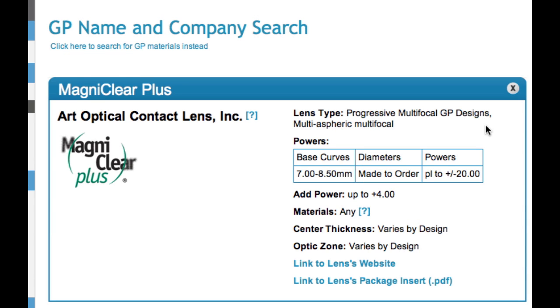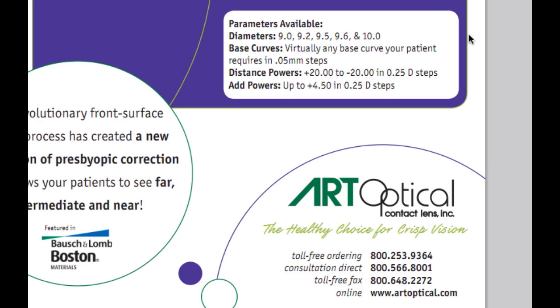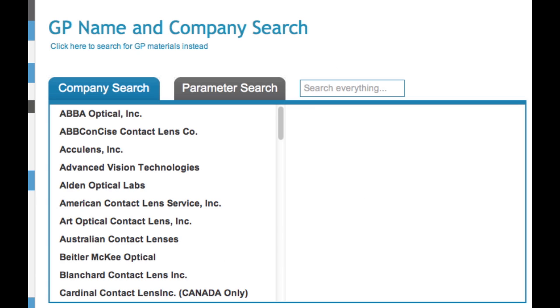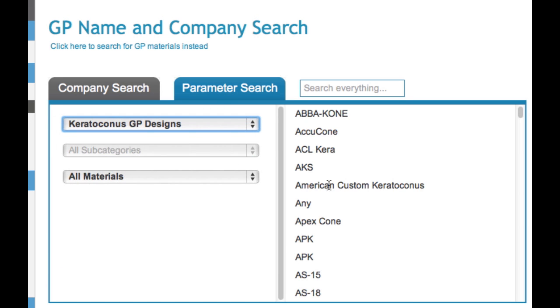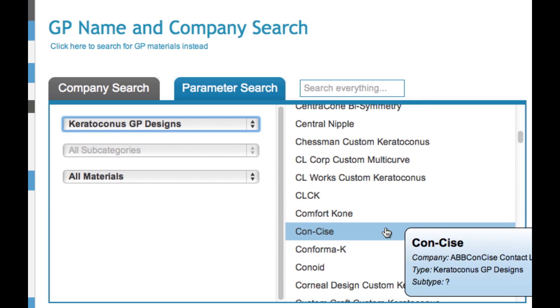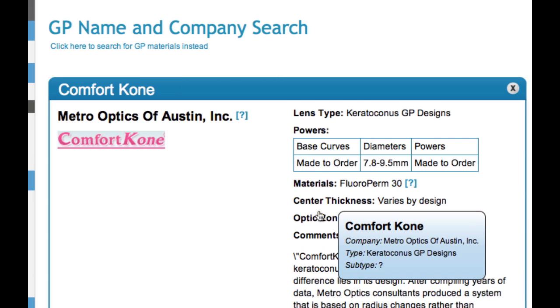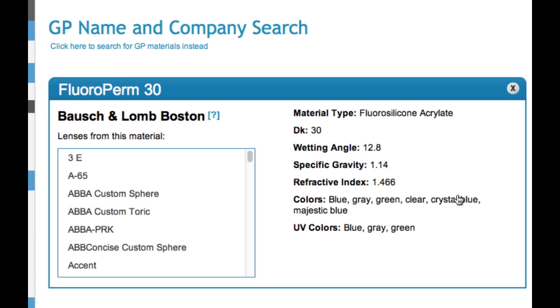For a lot of lenses, we try to have links to the website or, if possible, to a package insert, so you can get more information about fitting those particular lenses. We also have parameter searches where you can search by design categories. So if you want to find all keratoconus lenses, you can click on that and find all the keratoconus lenses. You can do that for multiple types of bifocal lenses too. Also, if you want to learn more about materials — this particular lens is made from Floraperm 30 — you can click the question mark and select the material you're interested in, and it'll go to a page showing the Dk, wetting angle, and all the parameters, including the different colors that the buttons come in.